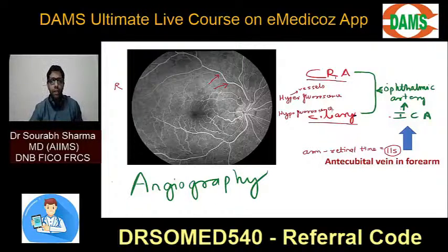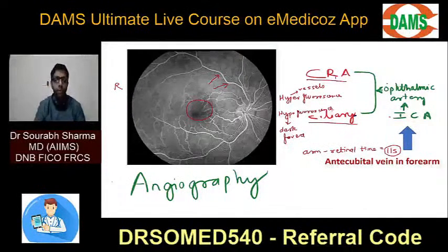Now can you appreciate this area? This area is the fovea. It is hypofluorescence. It is dark. Why is the fovea dark? Can someone think and tell why the fovea is dark on angiography? One very basic thing: how many layers were there in the retina and in the fovea? Sir, not 10, sir, 5 and 6.